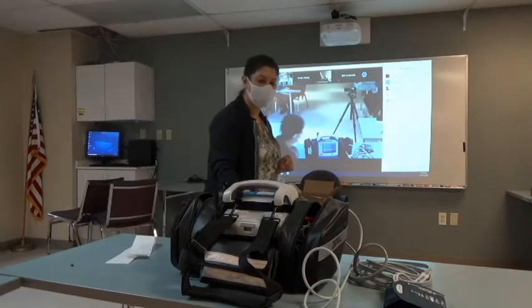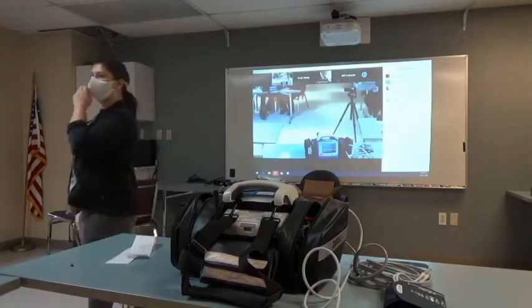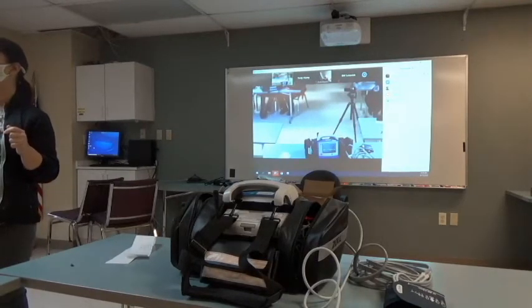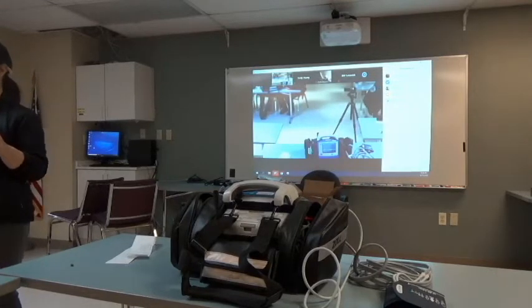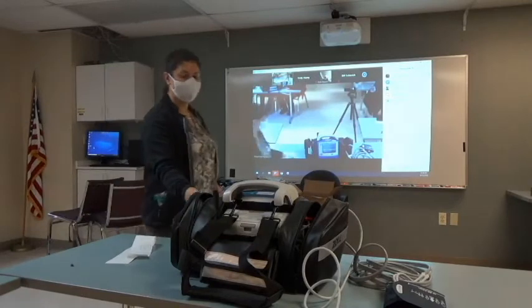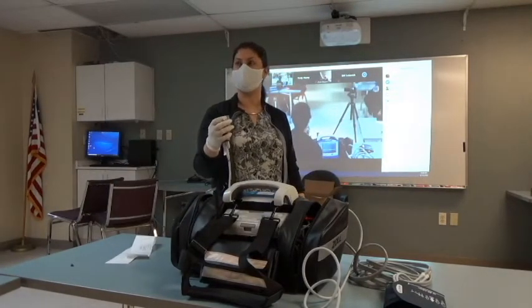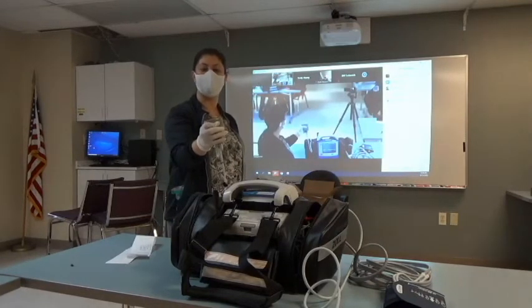Okay, go ahead and hit your back arrow key twice. For those of you that have a rhythm generator, on the end of the rhythm generator there is not the metal pigtail, but the plastic pigtail. Find the plastic pigtail and connect it to the notched end of the gray adapter. If you leave the gray adapter on, there's a notched end with a lightning bolt. That's where you're going to plug the pigtail in.